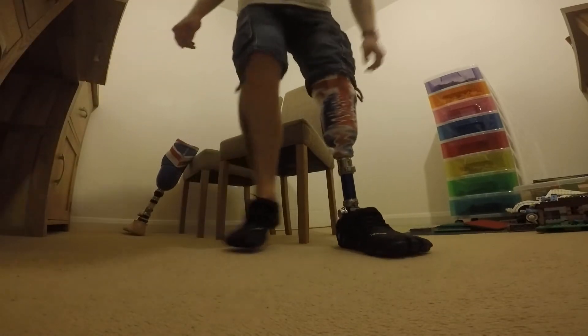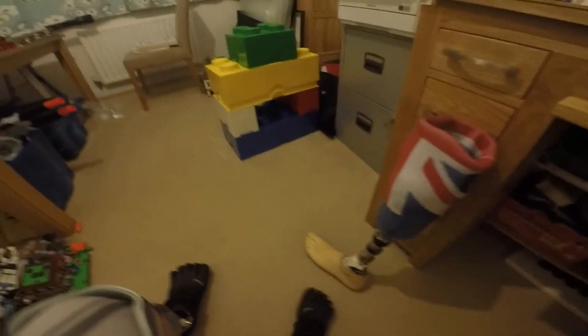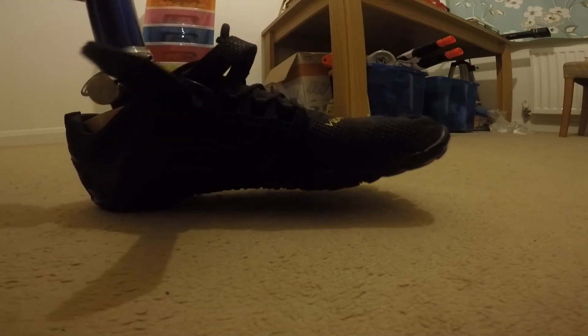It doesn't change the integrity of anything on the leg itself. I'll try to get in and out of the shoe there. I'll take the shoe off so you can see. This is my other foot - as you can see, these toes are all joined, so there is no movement, and there's no way that would fit into the shoe. And this is what's going on.